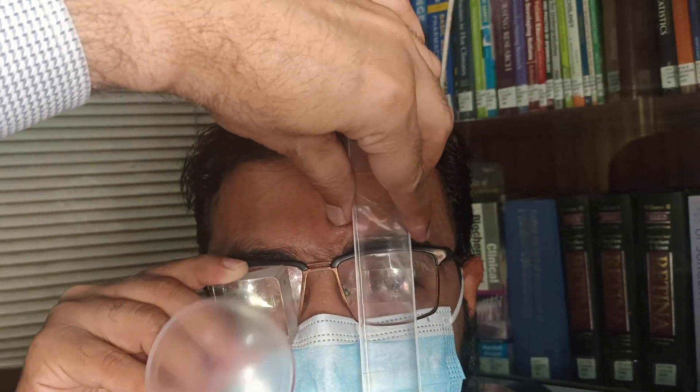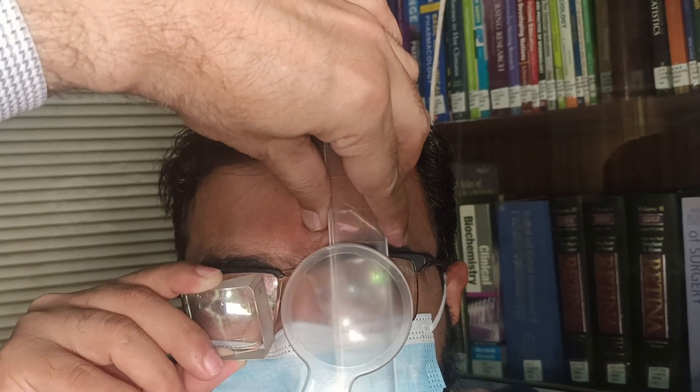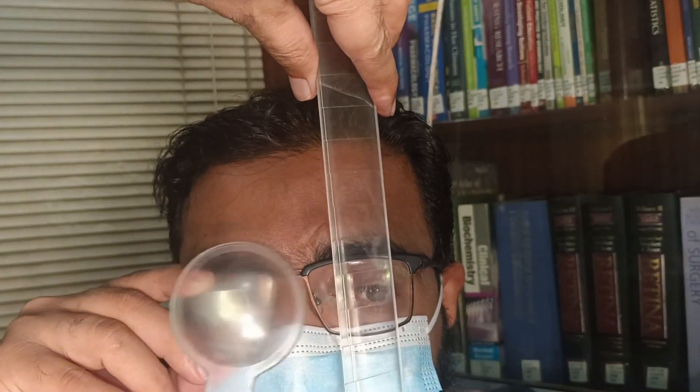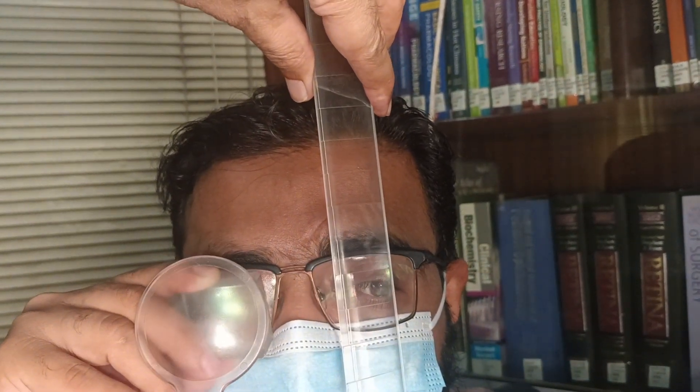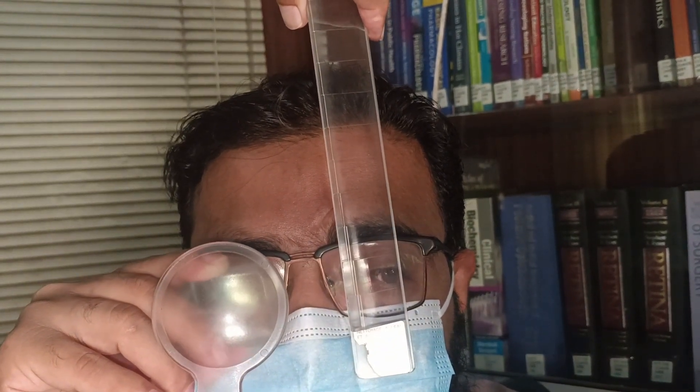You can see just by slight movement what the deviation is, and it is neutralizing at a higher level. If you go beyond this, the movement reverses — the eyeball goes from inside to outside. On conclusion, this patient had an exotropia which was more for near compared to distance. This indicates a patient with convergence insufficiency exotropia.